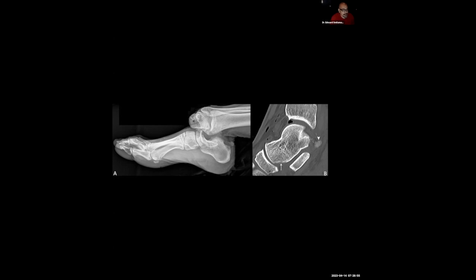Now, as you can imagine, subtalar dislocations typically happen with high energy traumas, but this has also been described in low energy traumas, such as basketball injuries as well. So something to be aware of. And classically, as these injuries are reduced, you may see an osteochondral impaction injury at the plantar aspect of the talar head/neck, and sometimes even talar body fractures posteriorly.